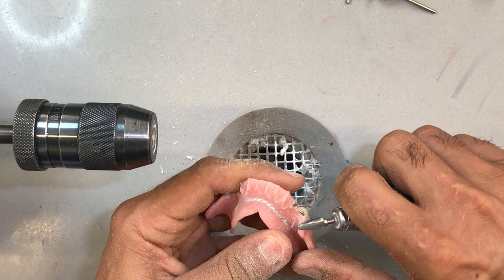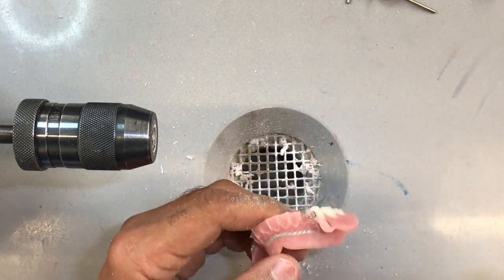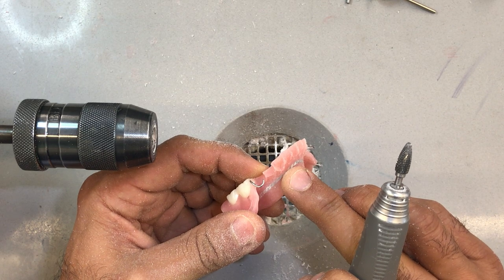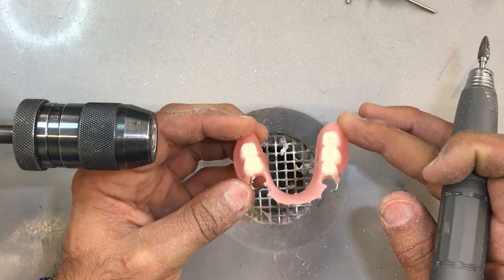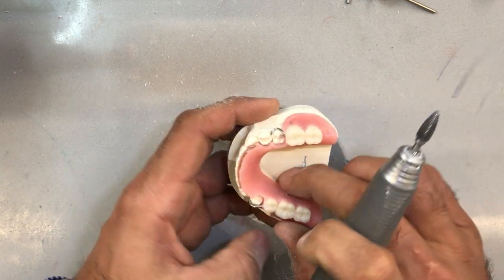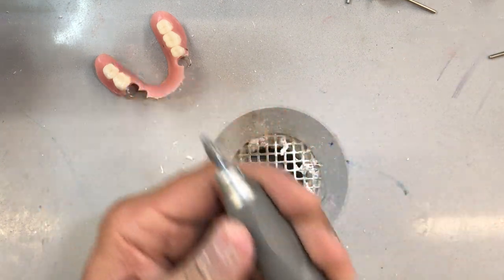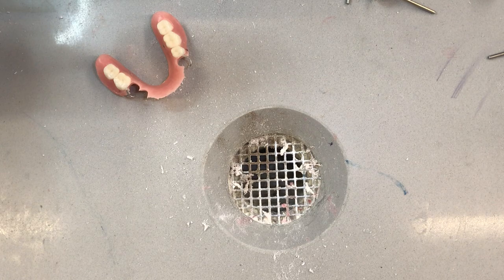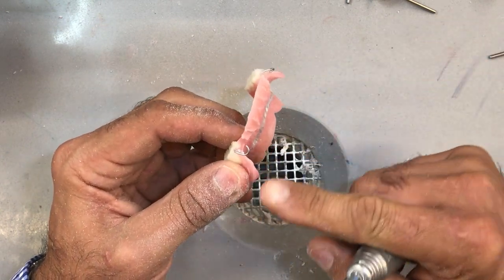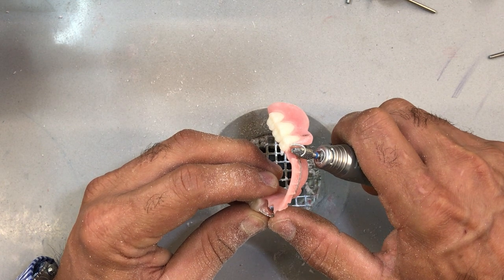Now the tricky part: we have to remove the undesirable undercuts below the height of contour. You want to remove just enough to have enough relief for this to slide over the model, because it won't right now. I'm going to use a finer tapered burr. You've got to play around with different burrs from different manufacturers. Now I have to imagine the path of insertion and create the path of insertion around this guide plane, to be the same on this side — which is not an easy thing to do.